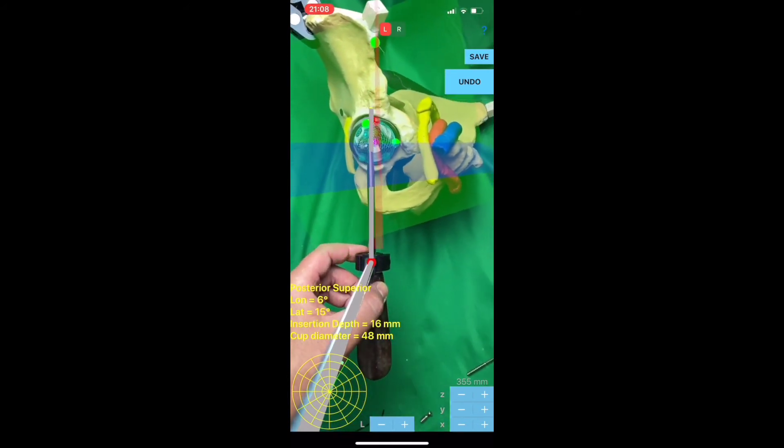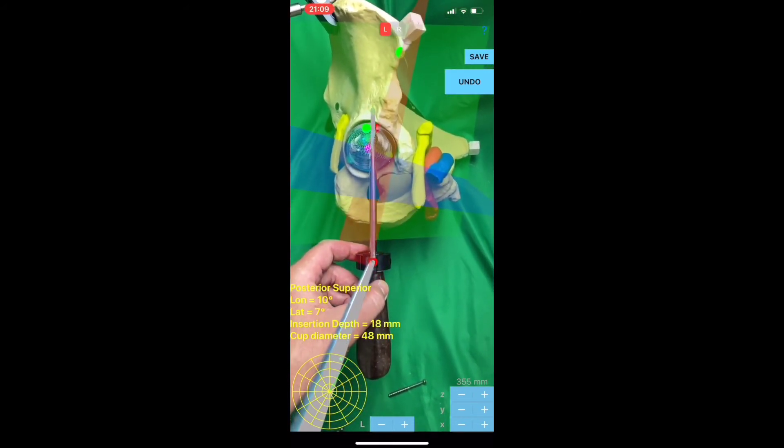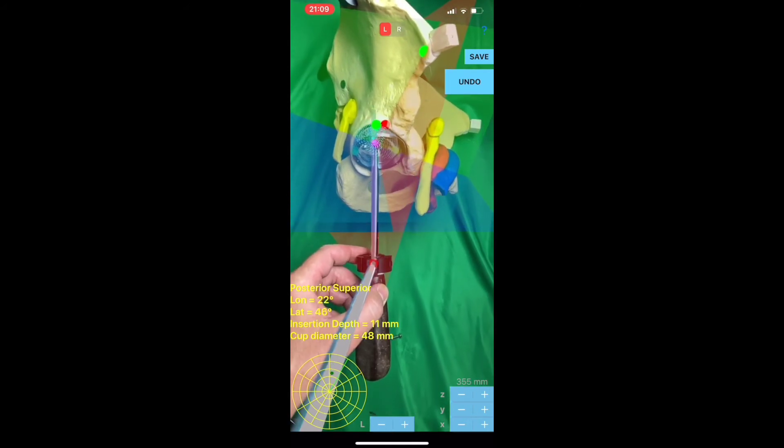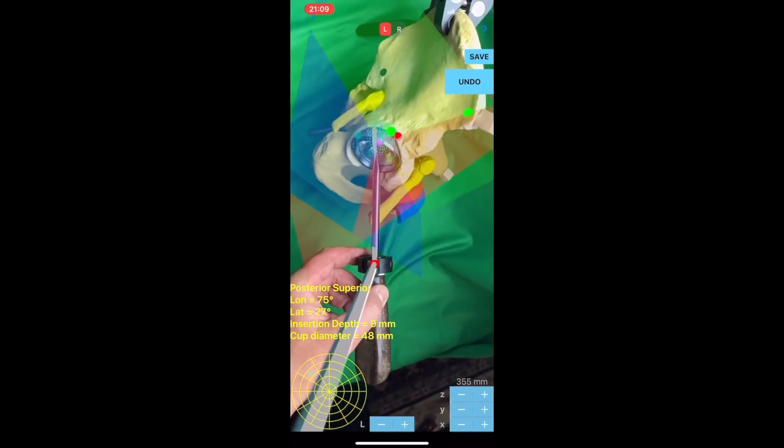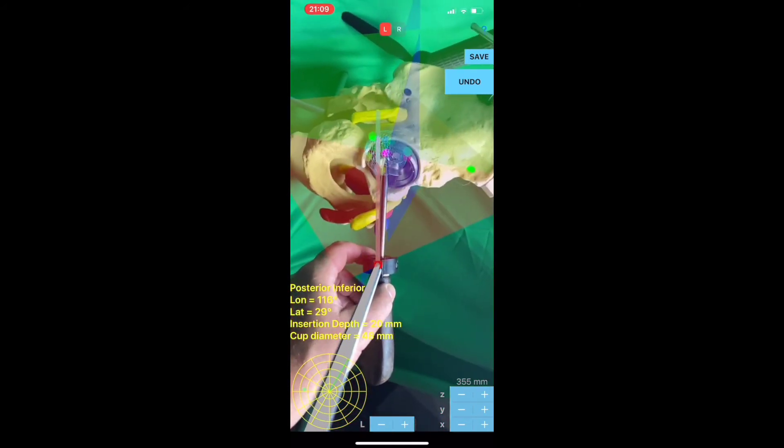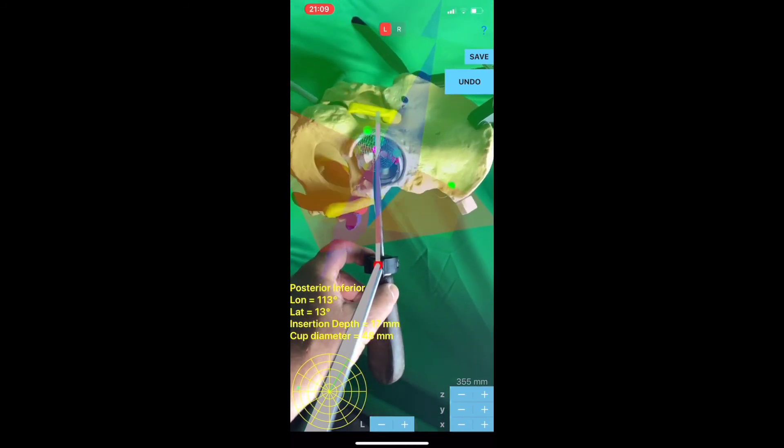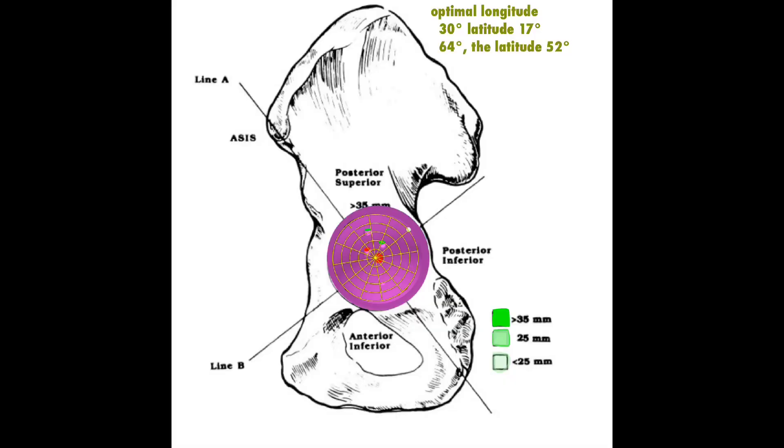Trans-acetabular screw placement could be helpful to place commercial cups into the acetabulum with given screw hole locations. The app provides intraoperatively a succinct topographical map of periacetabular depths, bone stock, and safe zones in relation to neurovascular structures based on anatomic studies reported by Vasilevsky et al.